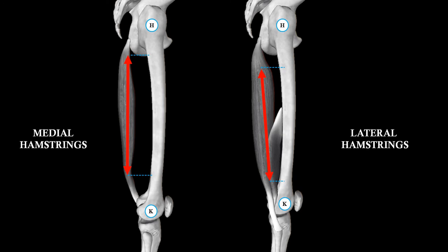We discussed very briefly needle electromyography and even more briefly mechanomyography. Are they better or worse? That would be a good area to read up on. Just a few cons. Superficial muscles are the only muscles that we can assess, unfortunately. Again, you can use needle electromyography to plunge a bit deeper, but unfortunately we're stuck with the superficial muscles. There is the possibility of the crosstalk phenomenon, where we start picking up on activity of the non-target muscle, or even the heart in some cases.